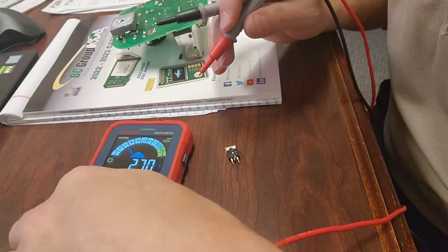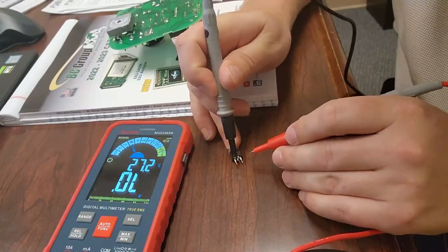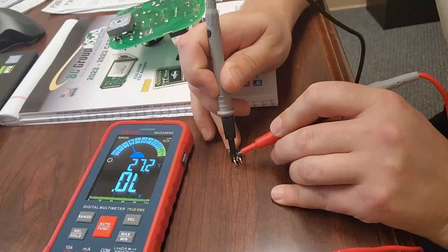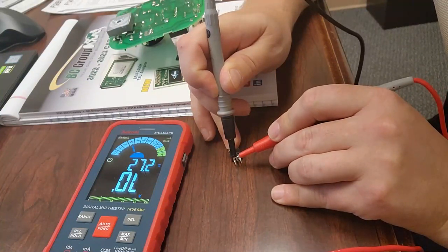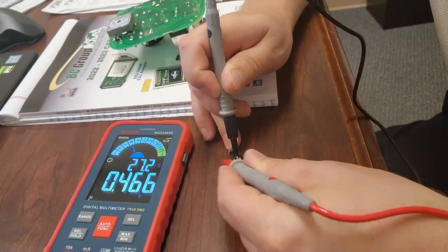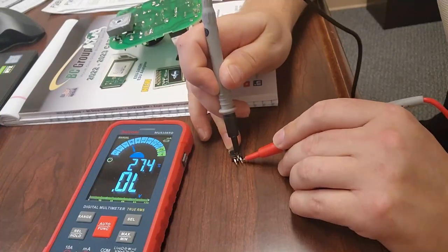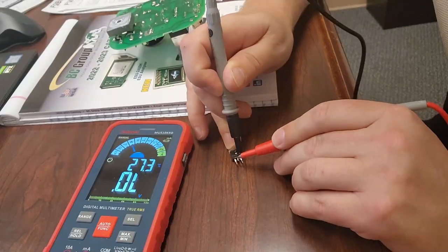Now to test the voltage drop on this guy, right? So what I'm gonna do is go to the first two because it showed that it was open or not continuous. So now you go to diode mode. In one direction, it should be zero. And in the other direction, you get your voltage drop. You see that? So that's why we use continuity and we use the diode mode. So now let's go to this side. See how we got 0 volts, dead short.